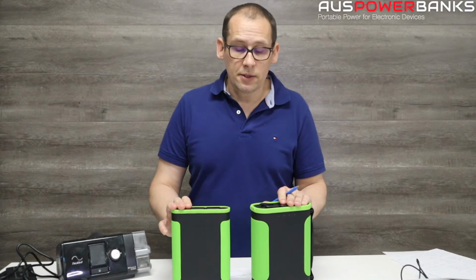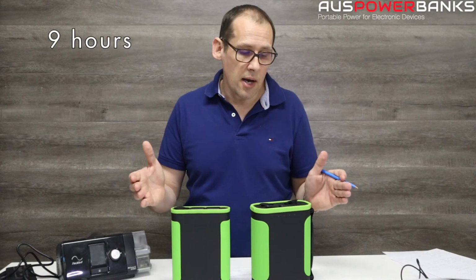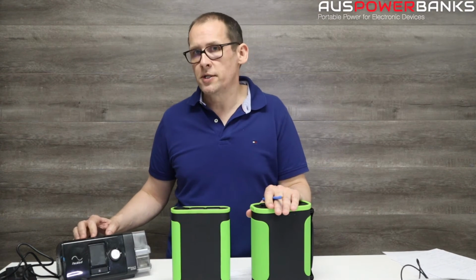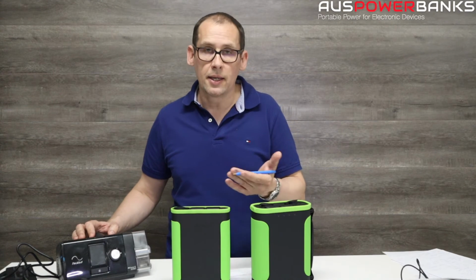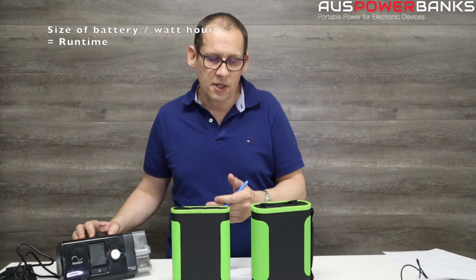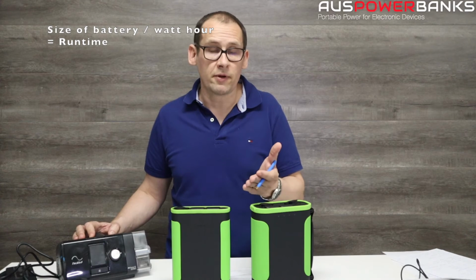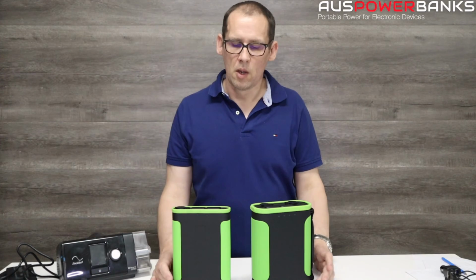Again, with the 96, you're going to double that. So on the 96, you're going to get roughly 9 hours. So you'd get a full night on this if you're using all the bells and whistles on this. So this is why it's important to go to your manufacturer's website to get the watt hour rating. The conversion is very easy. You roughly divide the size of the battery by the watt hour draw of the device, and that will tell you roughly, with a little bit of loss, the runtime.